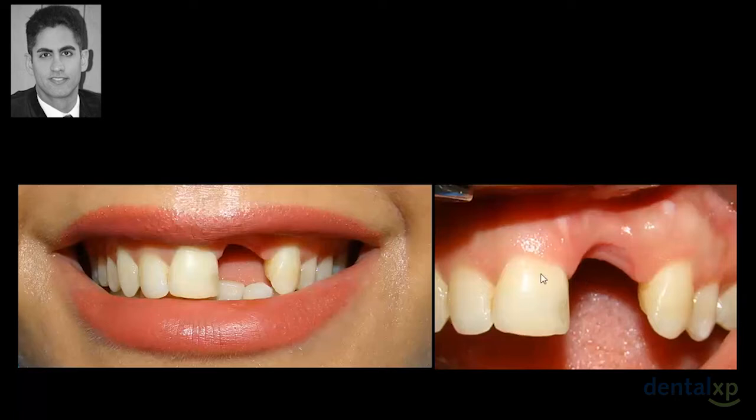Here we're facing a short clinical crown, so we can have a crown lengthening here to make it more proper, and at the end the patient should have some restorative work to make this canine look more like this lateral.